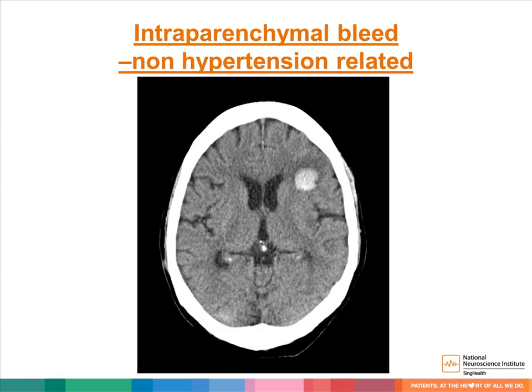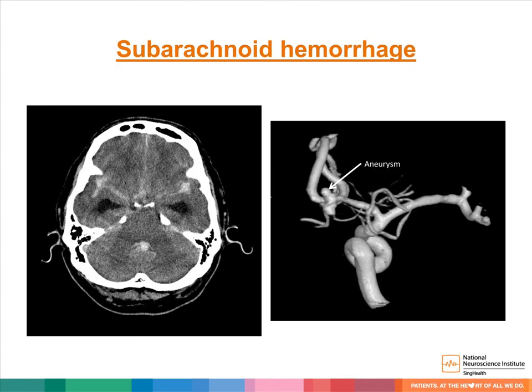This example shows a left frontal hemorrhage that is not hypertension-related. In this case, other causes of the hemorrhage need to be searched for. Another type of intracranial hemorrhage that can be seen in patients presenting with stroke is subarachnoid hemorrhage. In this example, we see diffuse subarachnoid hemorrhage associated with hydrocephalus due to a ruptured anterior communicating artery aneurysm.